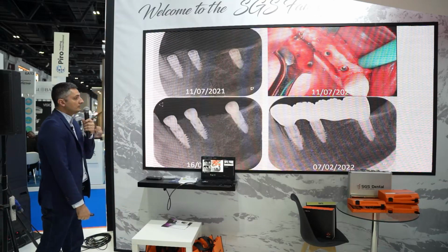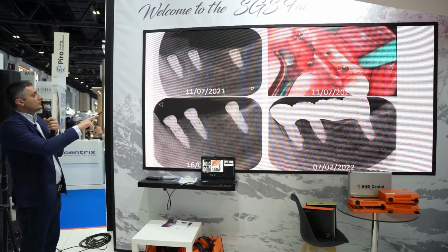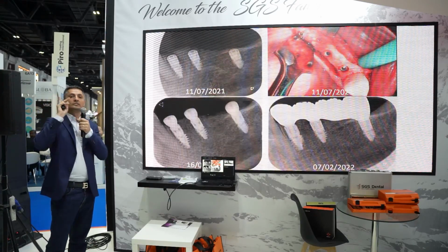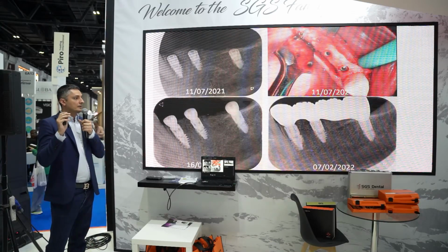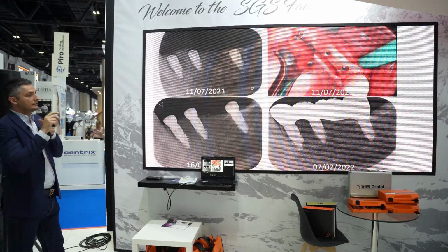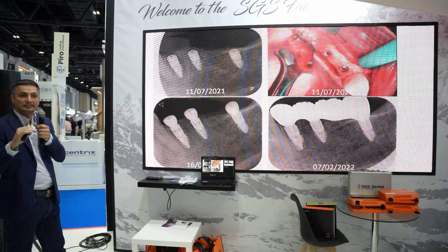Another case, mandible. So this is what I'm getting. Please, when you have bridges or 2 molars, splint the implants. Do not do single crowns. Splint the implants. And you will get a good result in the mandible if we try to use this technique that I'm using.